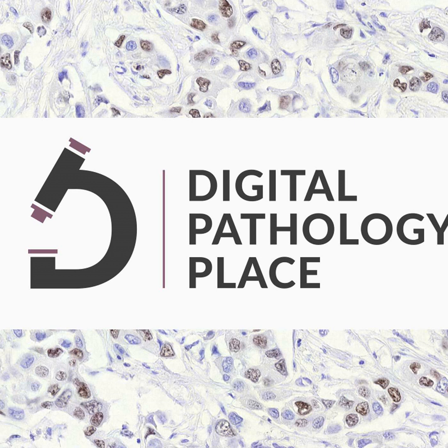These techniques can also be used in conjunction, augmenting their individual strengths. For instance, we can initially employ a deep learning approach to detect and categorize elements within an image, such as the glomeruli in kidneys, based on annotated examples. Once these elements are detected, we can then use machine learning methods to further classify them based on visible, handcrafted features such as size or color.